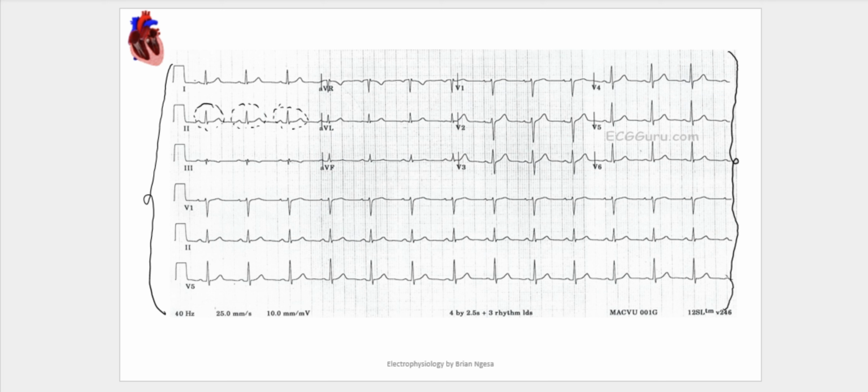The V6 will be telling a different story from lead 2 or from these other leads. That's why it is very important for us to understand how they are. But in this session, we'll dedicate ourselves to the normal physiological interpretation of these leads, or rather these electrical graphs, as displayed or collected with our leads.